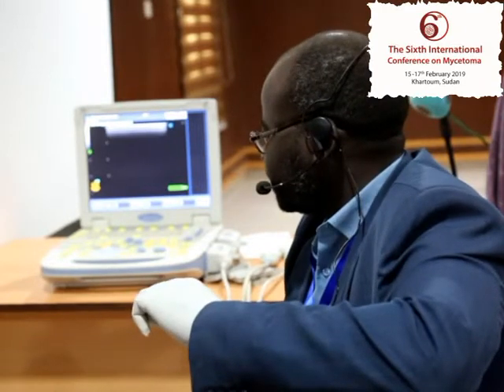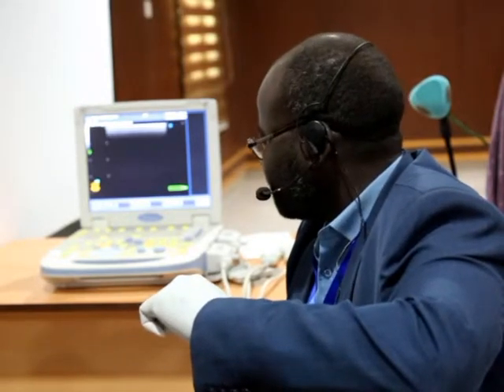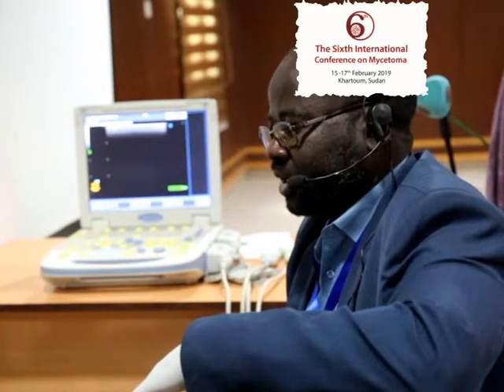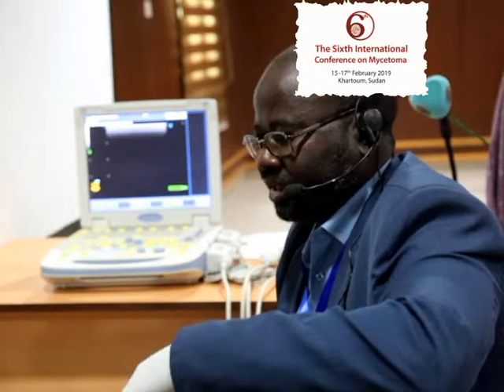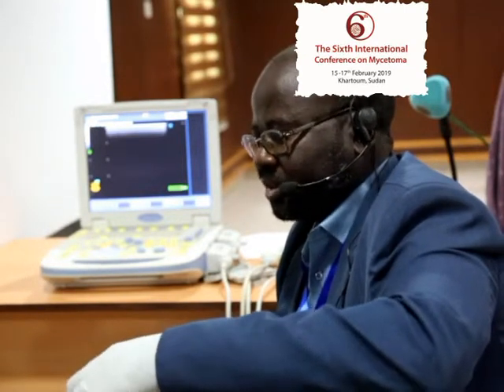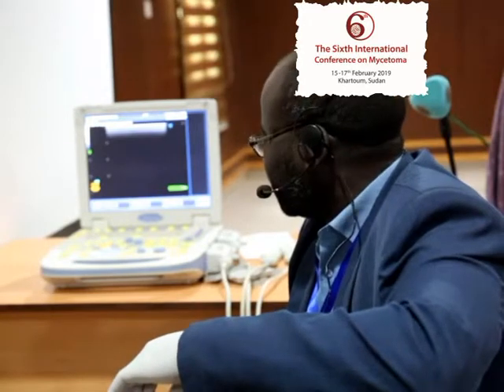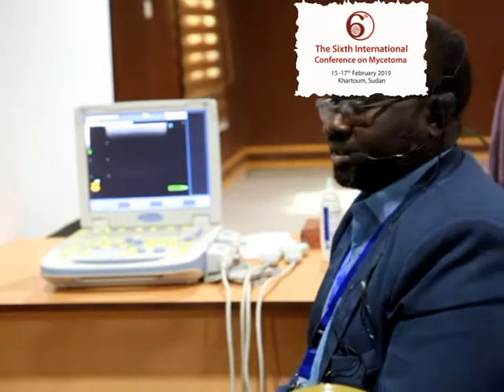Now I will start examining the patients. I will start with my first patient, a patient with a foot lesion. I will do the scan in front of your eyes and you will see what I'm doing, and I hope that this session will be an interactive one, so that during my scan, if any of you has a comment or question, we can answer that. Okay, let's start.